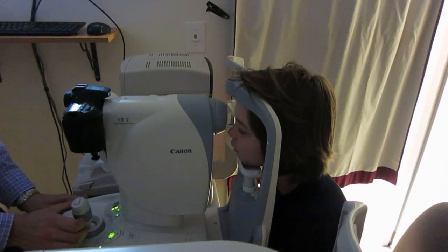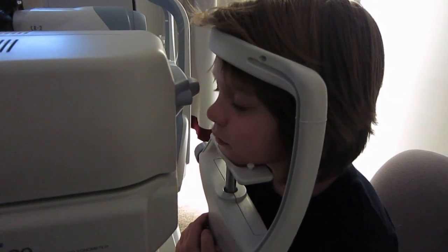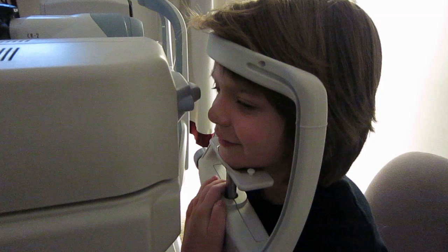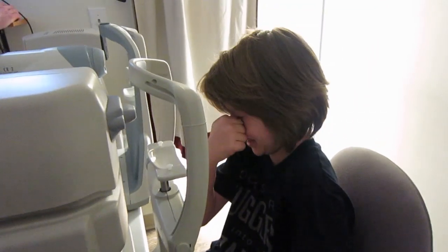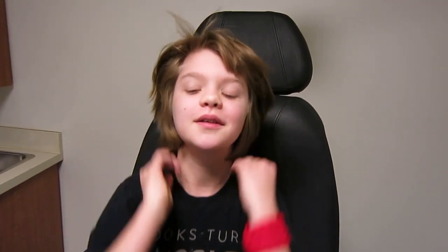Nice and wide, really wide — see if I beat your blink. Why we do this is it checks the pressure in your eye. I'm going to come close and it's going to give you just a little puff of air in your eye — it'll probably make you jump but it doesn't hurt, I promise. You barely even jumped — you did better than most adults, a lot better. So I just did some pretty simple eye tests, two of which were actually pretty startling — a camera flash and a puff in my eye. Now I think we're going to do some more complicated stuff.